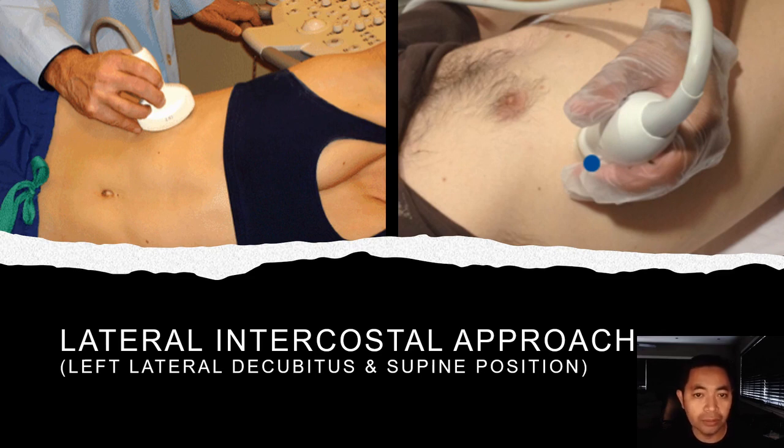Another commonly used approach is the lateral intercostal approach, which may be done in the supine or left lateral decubitus position. This involves scanning in between the ribs as the probe is placed along different intercostal spaces and the probe is fanned.